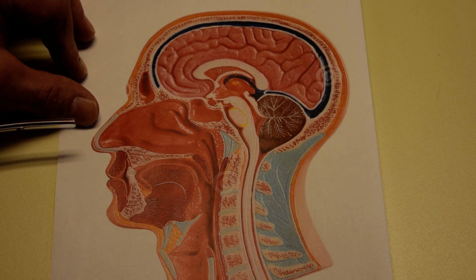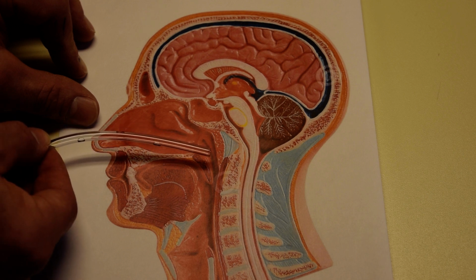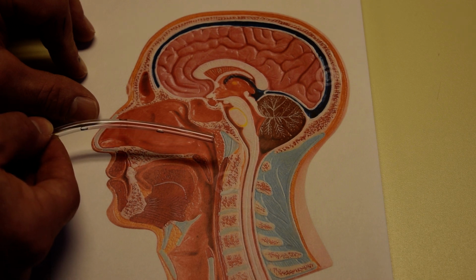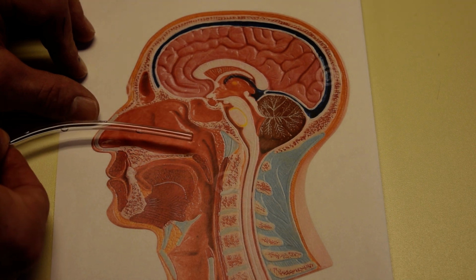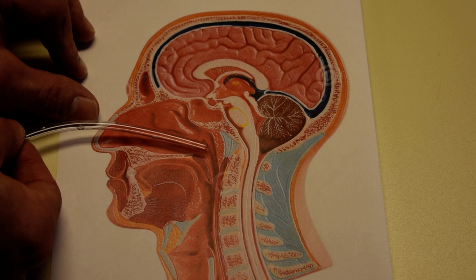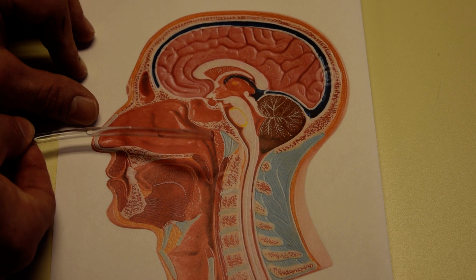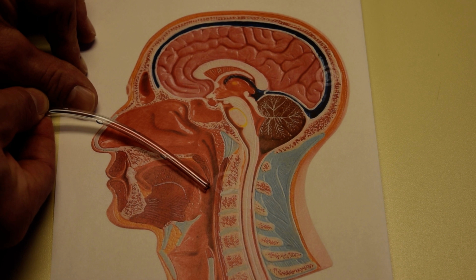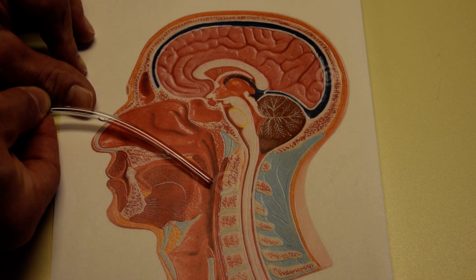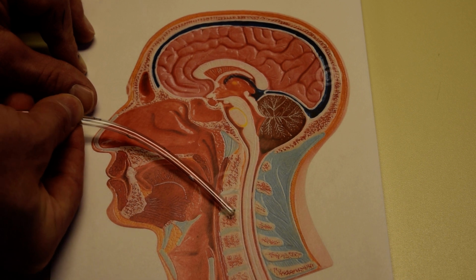So the very first step, and I will tell my patient this, the first thing we're going to do is I'm going to insert this and try to get it to the back of your throat. And we'll stop there and we'll regroup, okay? So I will insert the NG tube, and normally once you reach this point, there's a bit of resistance. I find sometimes if you turn the tube, if you twist it with your fingers, or you try to give yourself a bit of an upward trajectory again, and just gently press forward, you'll feel it give and head in the right direction.